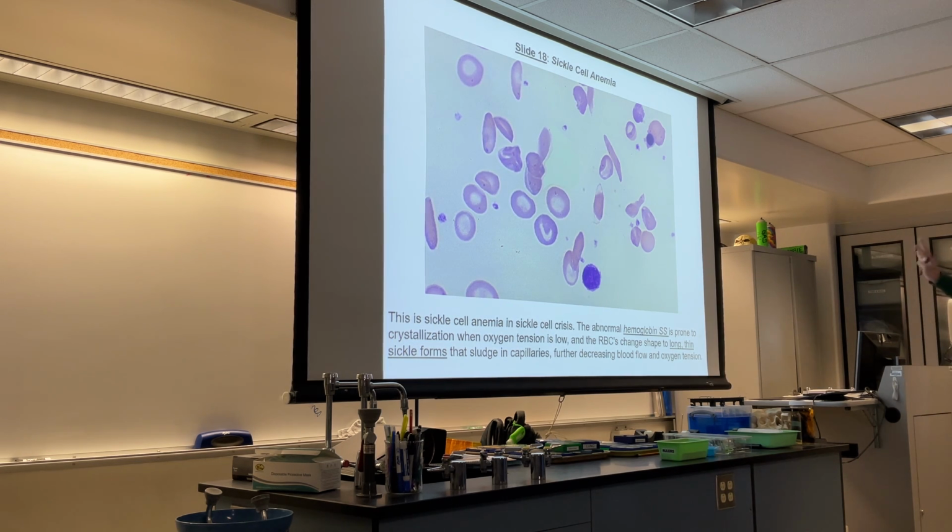This slide that you're looking at is somebody who is in what you would call sickle cell anemia crisis. Okay, so normal hemoglobin, you guys, and you should have learned this in your lecture videos, okay? Normal hemoglobin is comprised of 4 chains, 2 alphas and 2 betas.